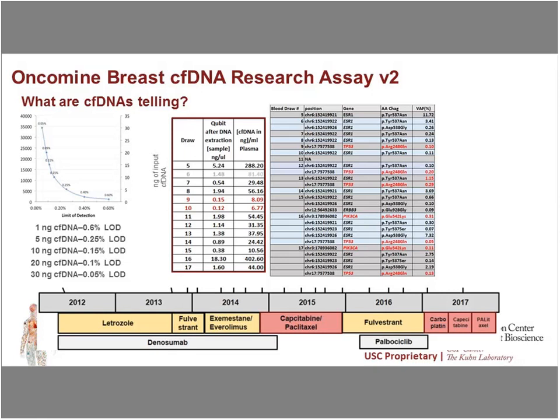So when we got the result for blood draw 9, it showed 0.1% VAF of TP53, but we just keep it in mind. This mutation is borderline, and theoretically with 8 nanogram input, this result is suspicious. But we repeatedly see this mutation in the later plasma samples as well. Then here is the table for the variant results obtained on this platform.